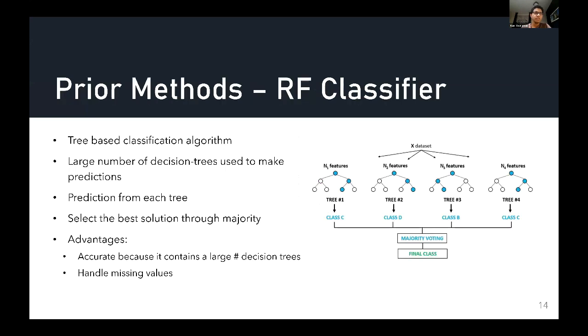So this is an unusual shift that's happening when we're going from a no murmur case to a with murmur case. This provides some insight as to what machine learning models should be used. We chose to use a random forest classifier, a tree-based algorithm, as we could encapsulate this shift going from a no murmur case to a with murmur case.